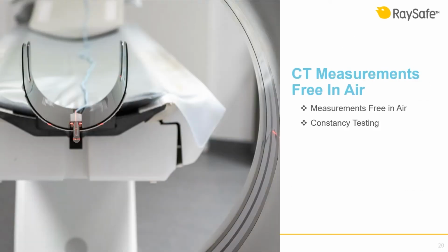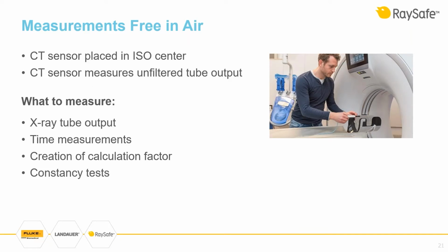Okay, we have now covered how our CT sensor is designed. We will now continue with how to use the sensor, and we will start talking about measurements free in air. Measurements free in air means that we place the sensor free in air without any phantom present. And some measurements are better made free in air.